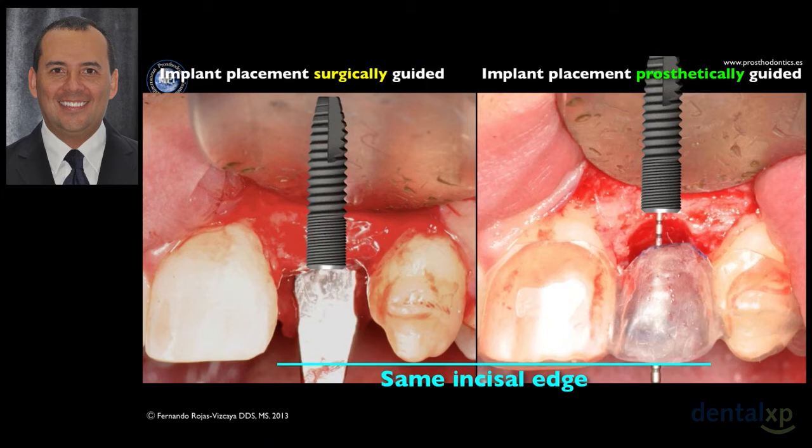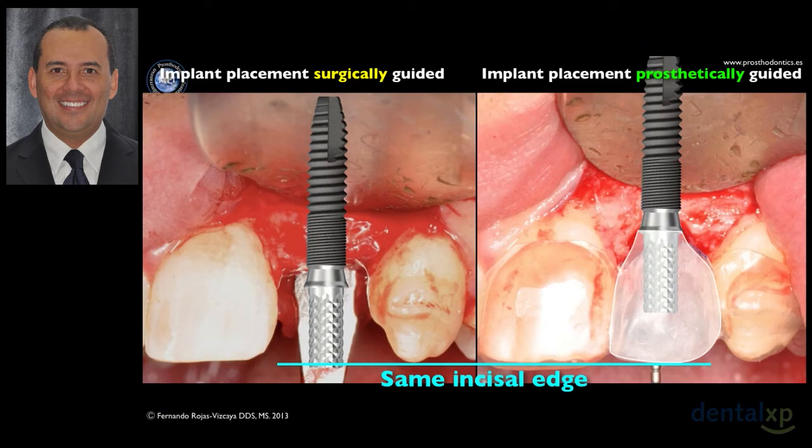This is a case that I can see many times. Place the implant just where is the bone. Now take a look. In both cases, you need to connect an abutment, right? To make a crown. Now you can see that one of the crowns is very short.